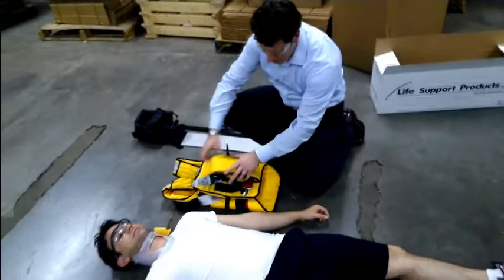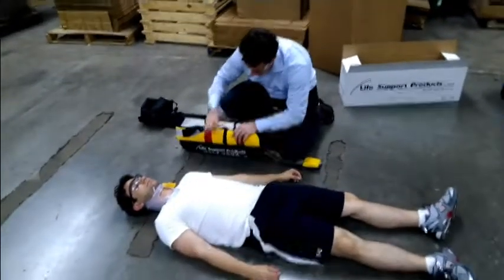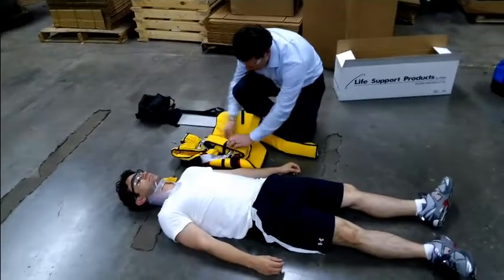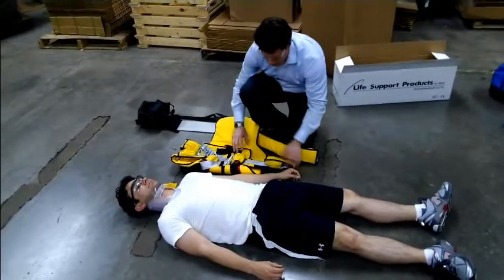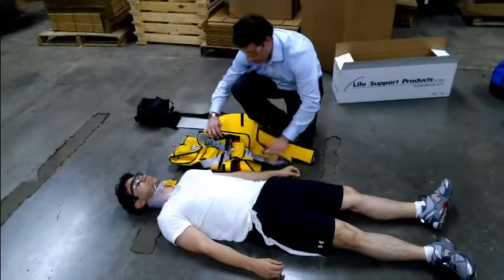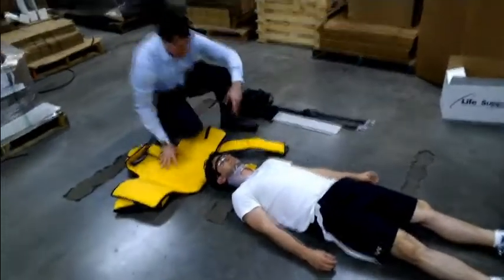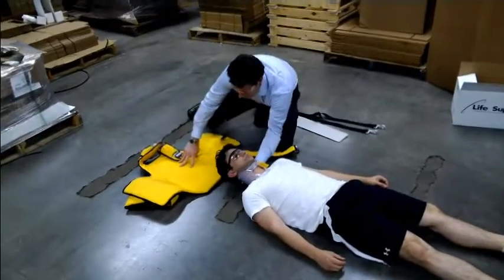The Halfback comes neatly stored in its storage position. The first thing that needs to be done is to remove the Velcro straps to free the leg straps. Once the leg straps are free, the device can be opened up and positioned underneath the victim.